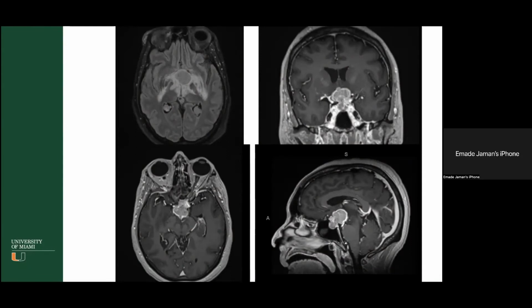The contrast MRI shows a diffuse contrast enhancement and maybe also a capsular component encasing the mass. Yeah, good. So there's a sellar and suprasellar tumor. There's patchy contrast enhancement, especially around the rim of that capsule, like you described.